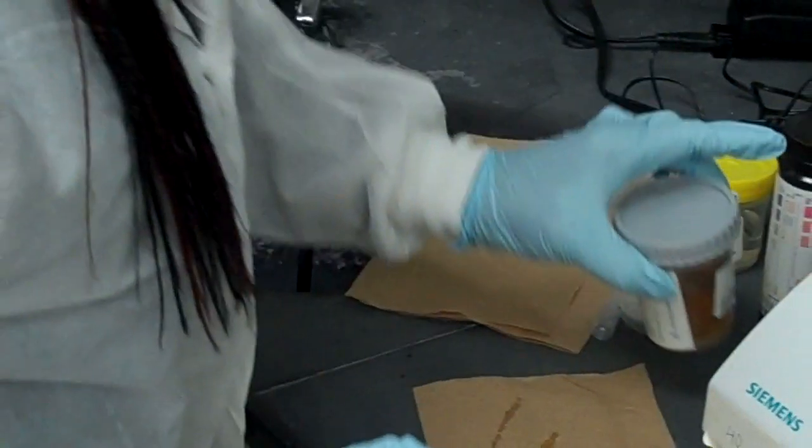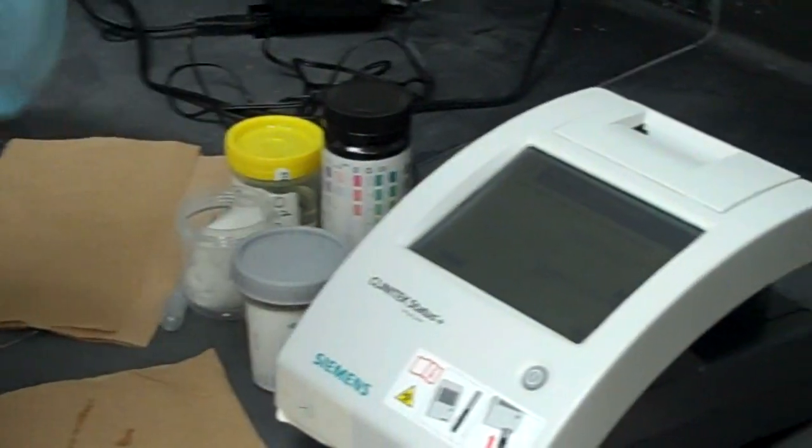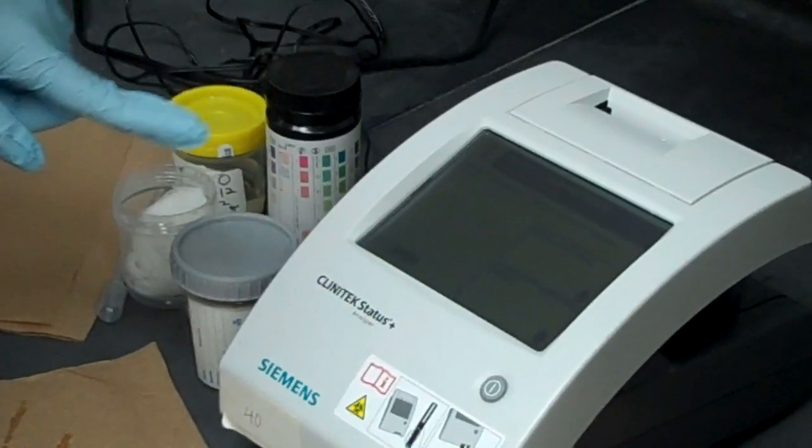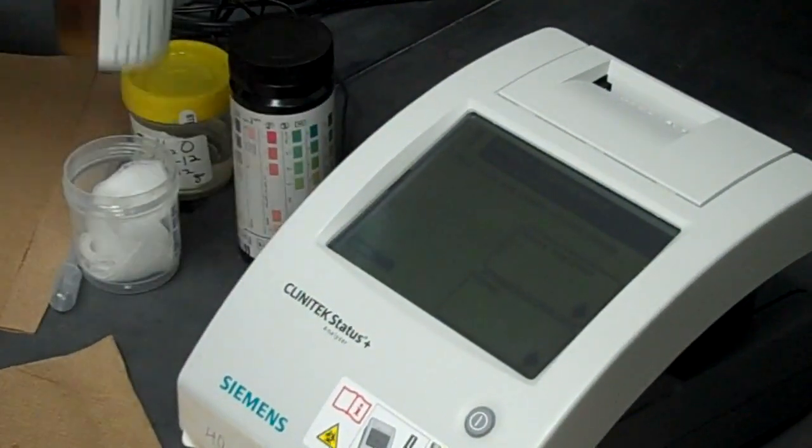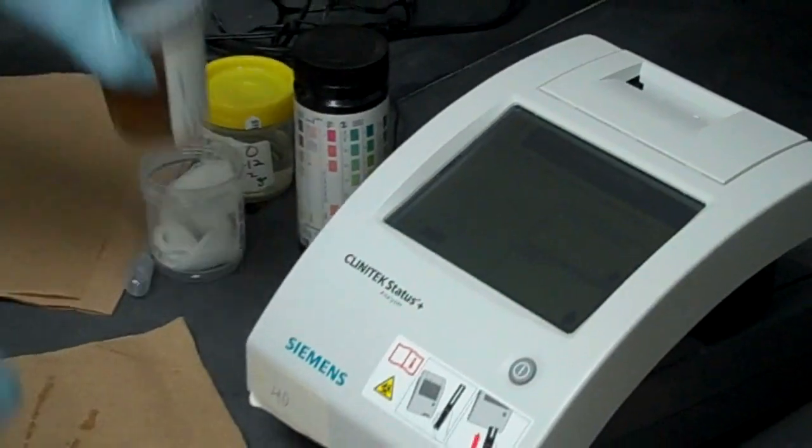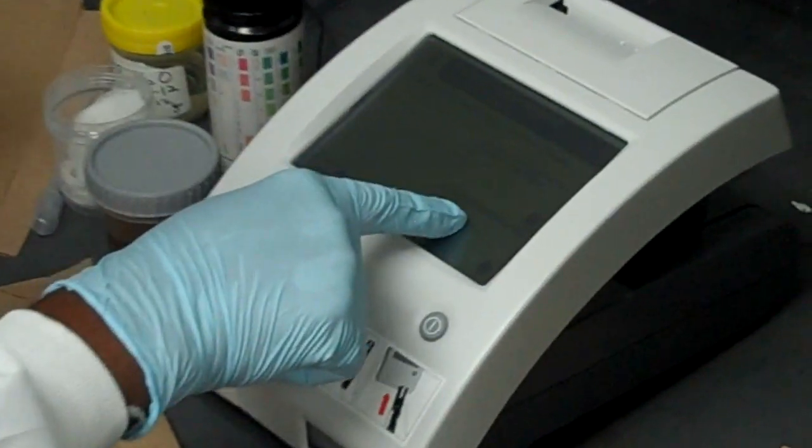While that's happening you look at the color of the urine. And you're going to select if the urine is clear. It's yellow and clear. You select that button. If not you select other. In our case our urine is brown. So you select other.